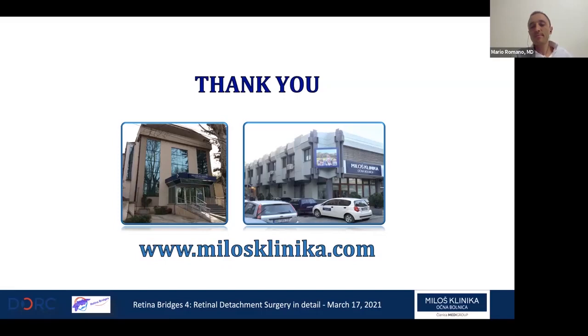Thank you. And one question from Zoran. When you suture next to the sleeve, do you suture both overlapping bands together or only the lower one? Only the lower one, the band, not the sleeve. Thank you. Can you stop sharing?